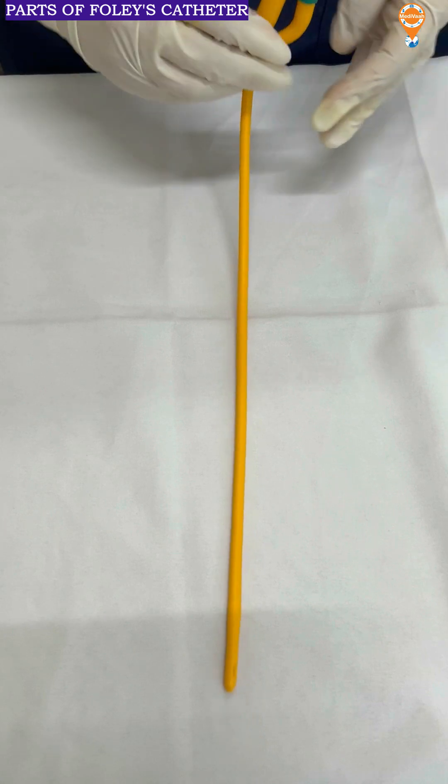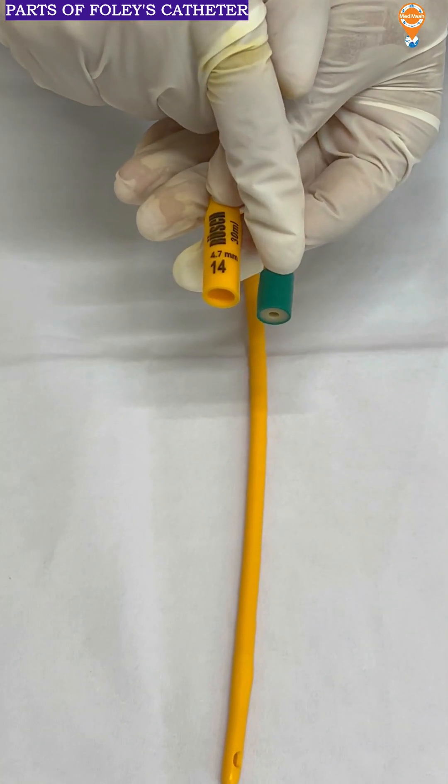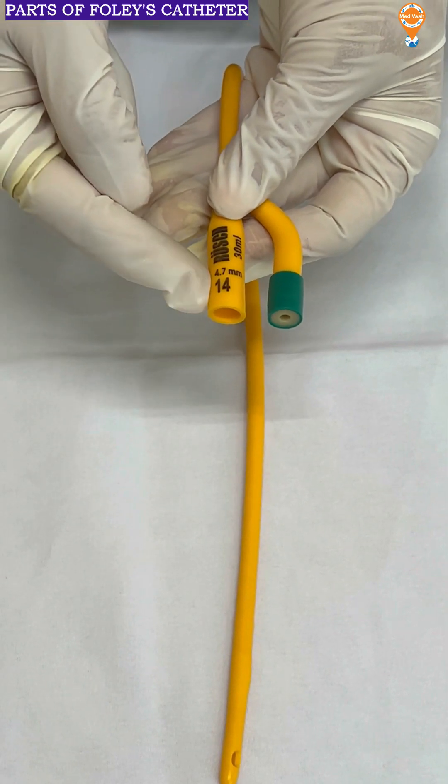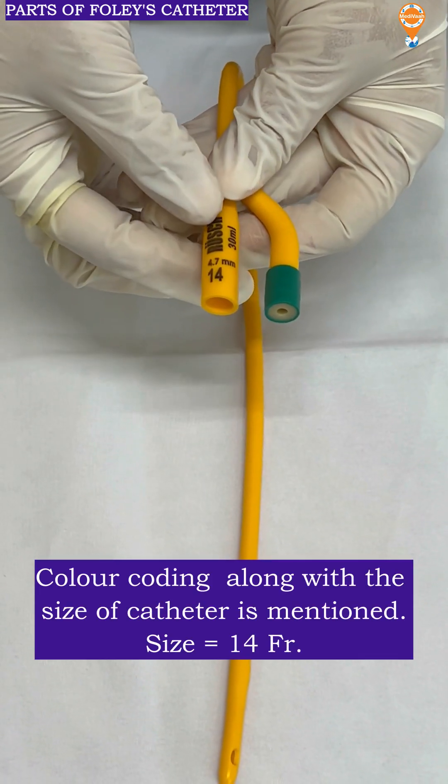To begin with, the size can be seen as it is color coded green. So it is a 14 French — it is also written over here. So this is a 14 French Foley's catheter.